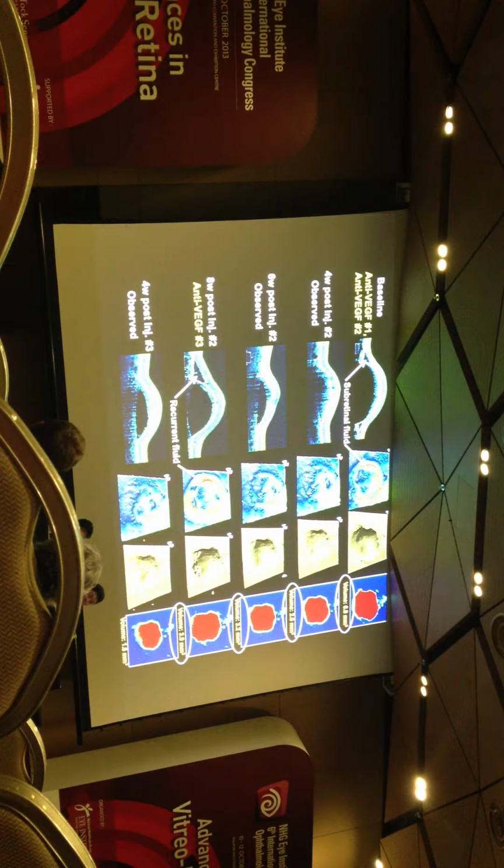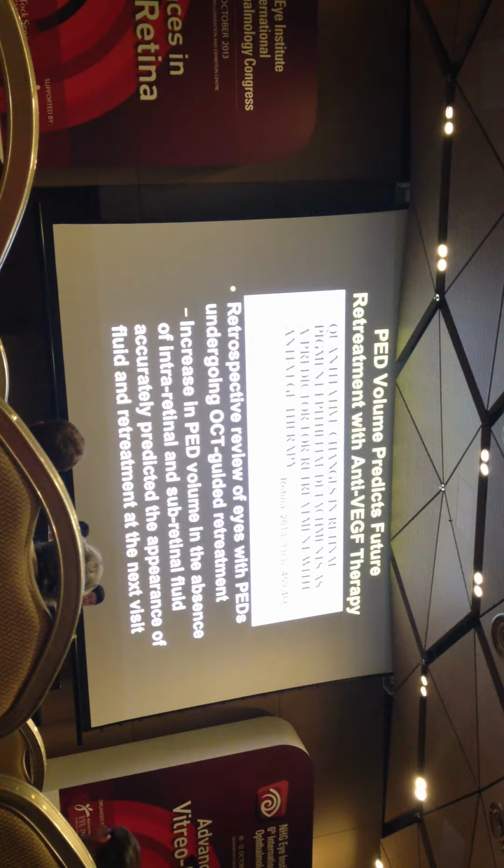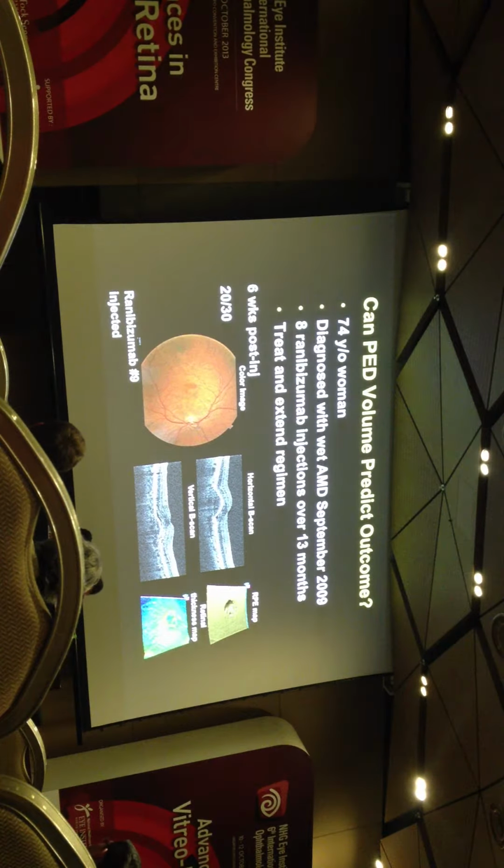We then extrapolated with a bunch of studies, a bunch of cases, retrospectively. We went back in all our PRN treatments, and we found that when we looked at the volume measurements of PEDs and we didn't treat, and then we needed to treat the next visit, the volume had already increased at the visit we didn't treat. So an increasing PED volume was a harbinger, an ominous sign of needing to treat later on. I'd be fascinated to find out if you see the same thing with polypoidal lesions.